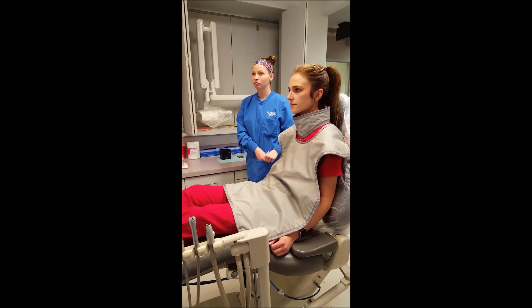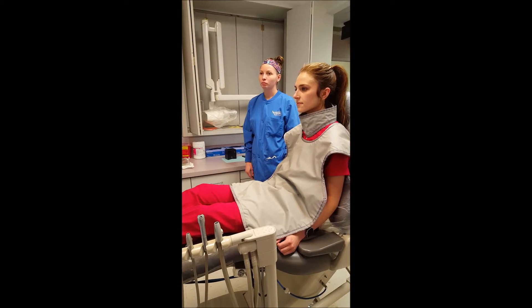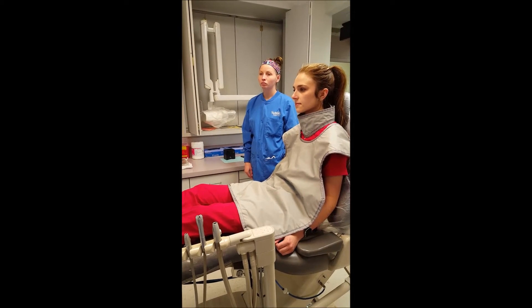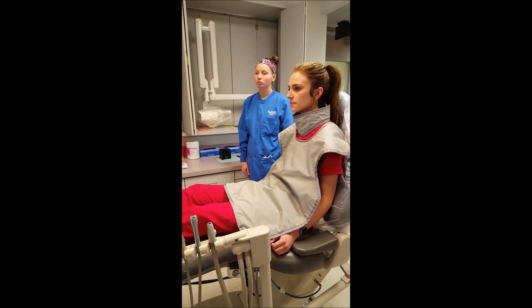Bite wing radiographs capture the crowns of teeth of both maxilla and mandible in one image, most commonly made of the posterior teeth, used to detect the interproximal caries, calculus, and bone levels around the teeth.